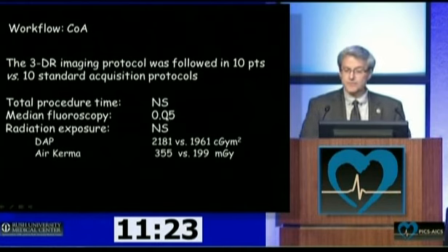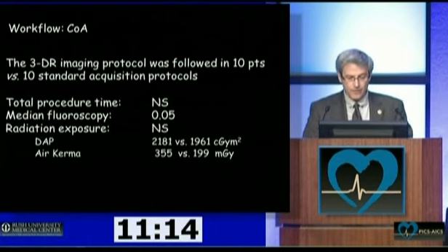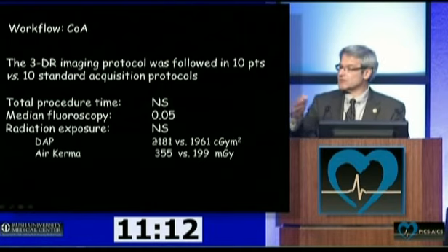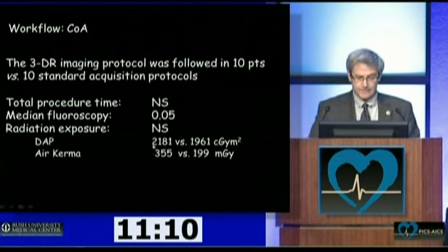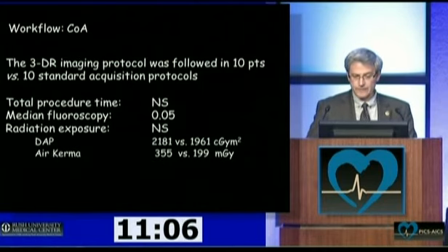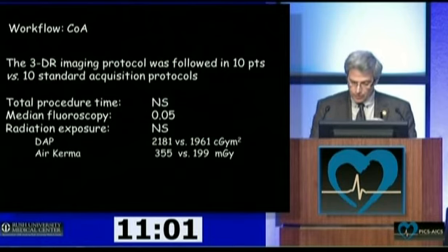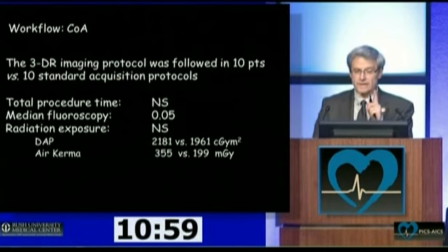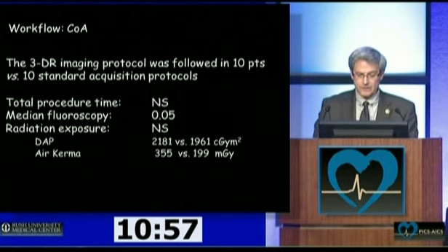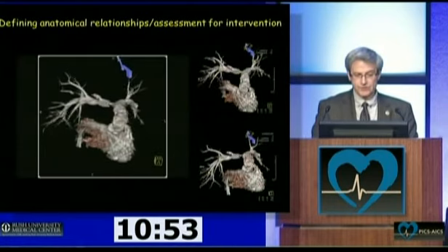The median fluoroscopy time was obviously less with the Dyna CT, and the overall radiation exposure was not significantly different, although the ranges of the DAP and the air kerma were very, very wide for both groups. So the overall radiation exposure with one Dyna CT acquisition was comparable to standard multiple biplane acquisitions.